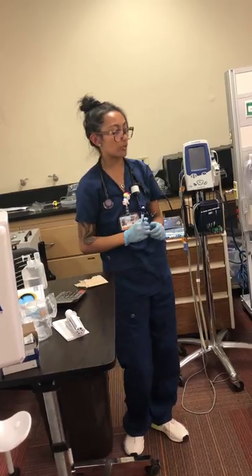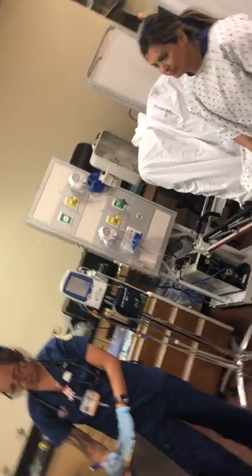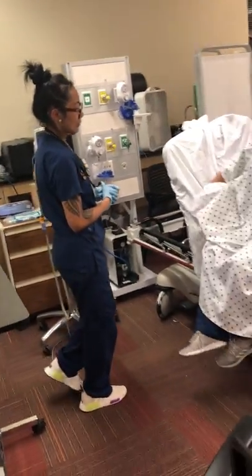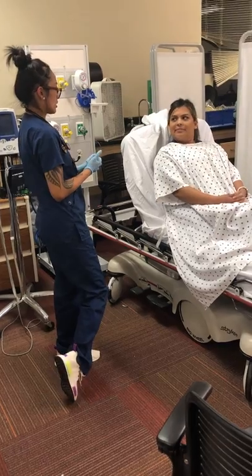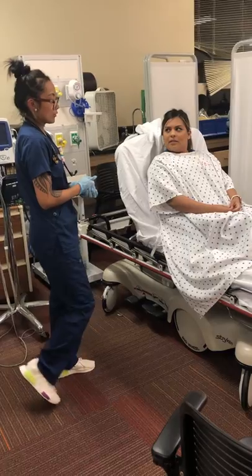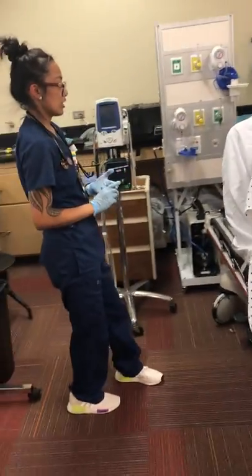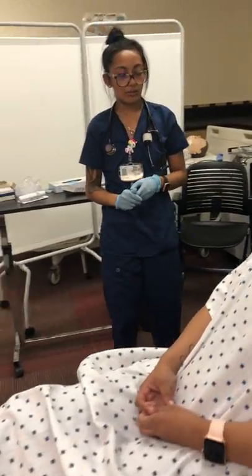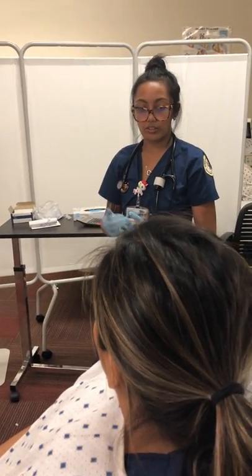The Duoneb did help your lungs a lot — you're now able to breathe a lot easier. Do you need help getting back into bed? No. Did you have any questions about what we did today? No. Did you need help with anything else? No. From what we did today, I'm going to make note of it in your charts and talk to your nurse and doctor about what we did and how everything went. I'll also fill out a flow sheet about all the things we did so that it stays on your record.